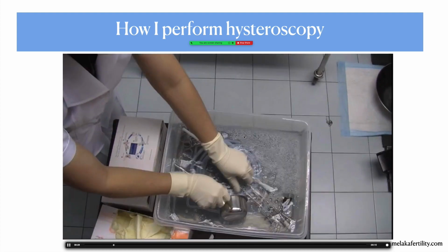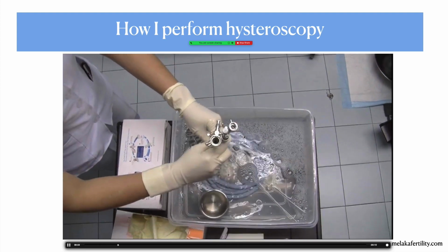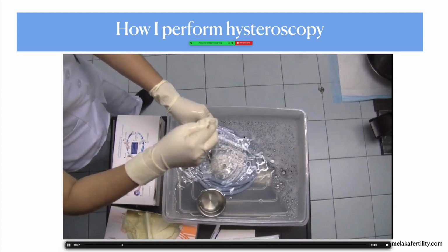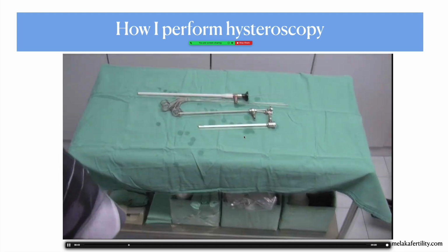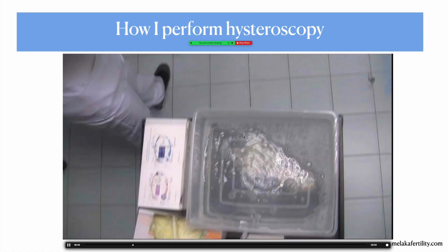I'll be seeing patients in my other room, which is just adjacent to this room, while this is being done. And when it's ready, then I'll perform the office hysteroscopy. Now, she has of course soaked all these instruments and gotten them ready. And once the instruments are ready, she will prepare by sleeving the telescope. And here this is the light cable.